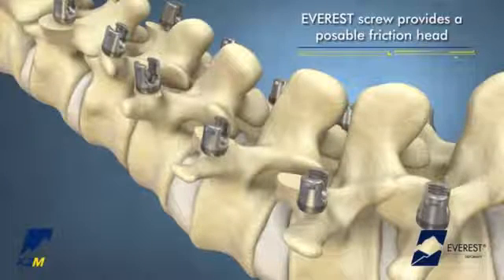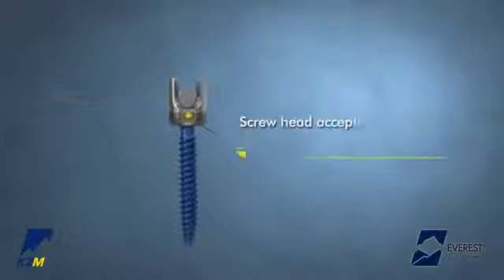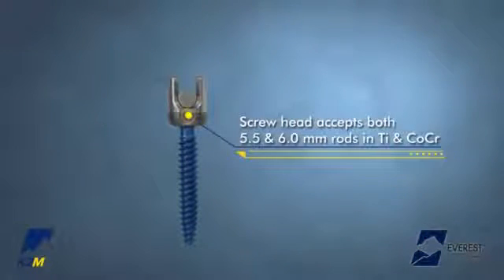After the screws are aligned in the desired plane, the appropriate rod size and material is selected. The Everest screw can accommodate both a 5.5 and 6.0 mm diameter rod in both titanium alloy and cobalt chrome.